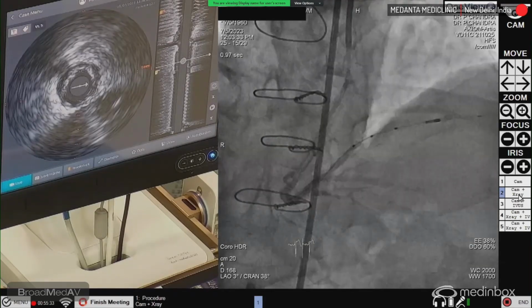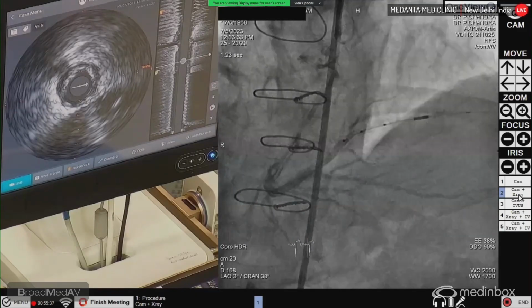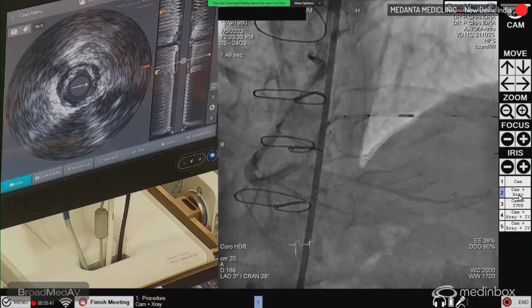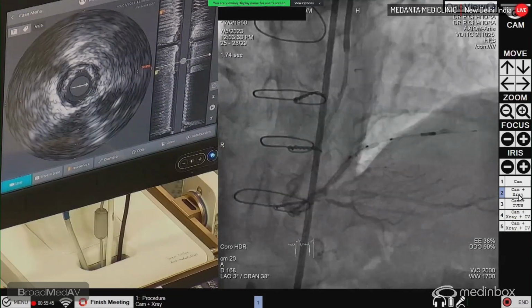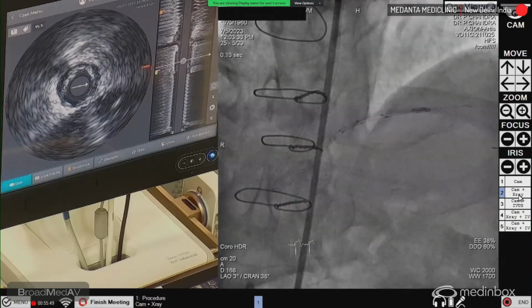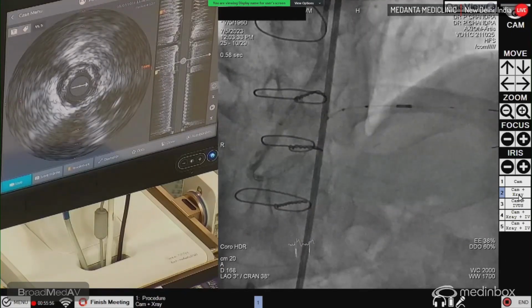So minimum we need a 36, is better. Okay. We'll take a 36 or a 38. Or maybe a 40 is also fine. Give me a 40 then. 2.5. SR. Give me.